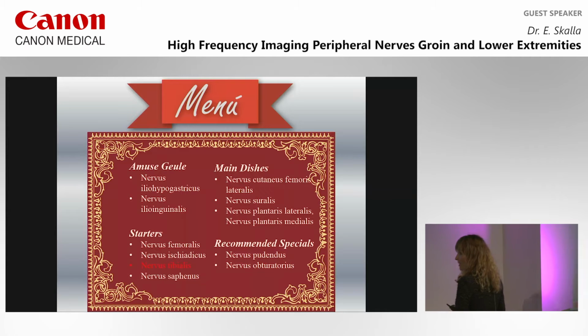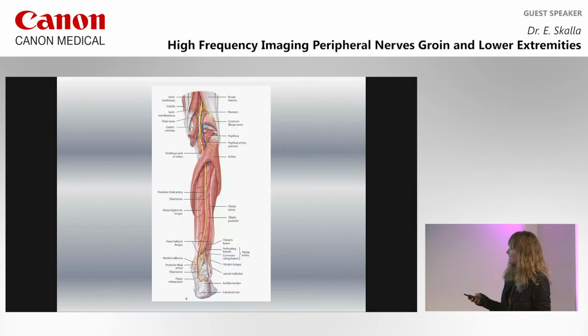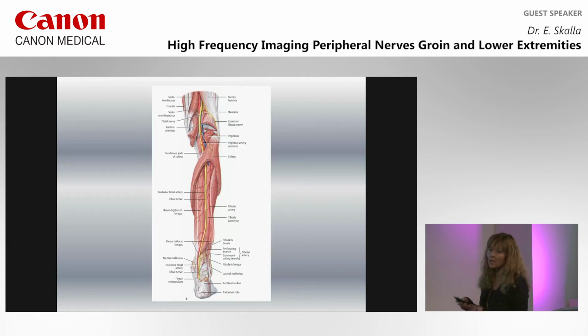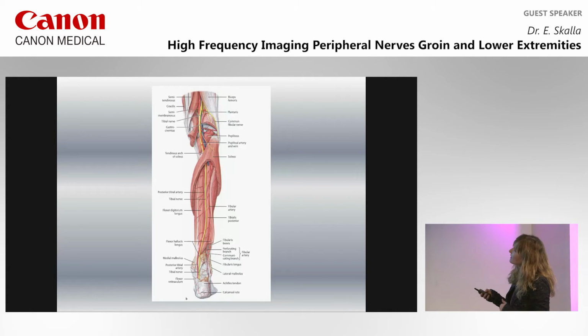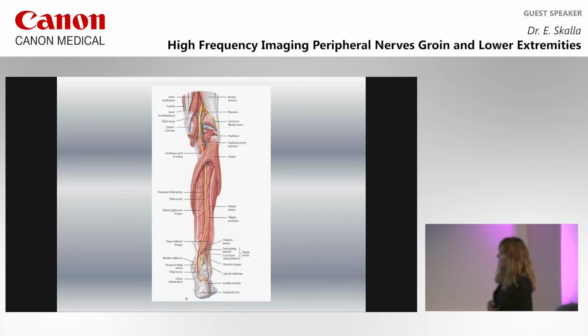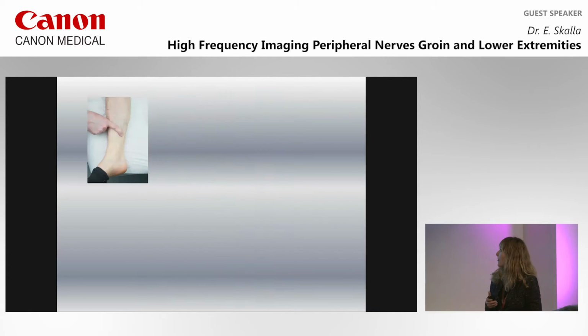So, one branch of the sciatic nerve, the tibial nerve. I think anatomy is clear. It runs straight downwards through the popliteal fossa, in the center of this fossa, and then goes in the deep under the tendinous arch of the soleus muscle and runs in the flexor compartment to the medial ankle, just straight downwards in between the muscles.